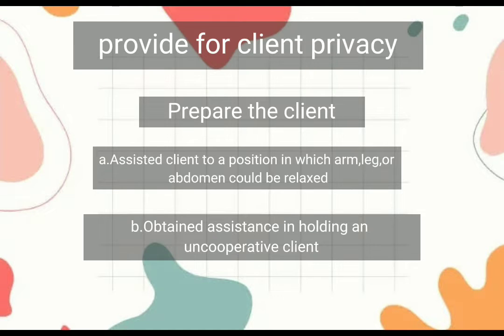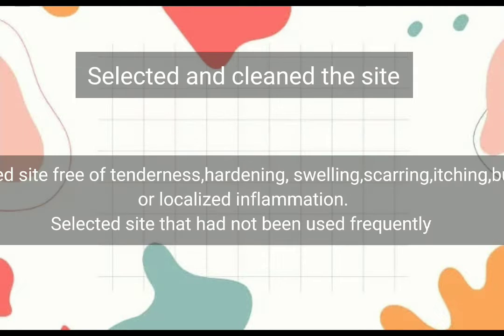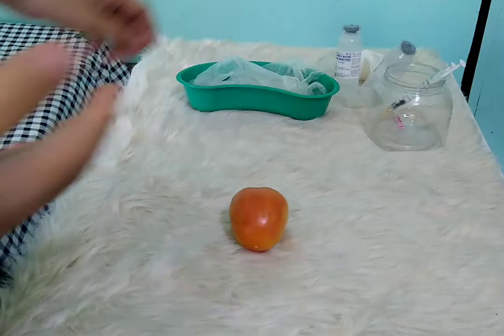Provide for client privacy. Prepare the client. Assist the client to a position in which the arms, legs, or abdomen are relaxed. Obtain assistance in holding an uncooperative client. Select and clean the site. Select a site free of tenderness, hardening, swelling, scarring, itching, burning, or localized inflammation, and one that has not been used frequently.